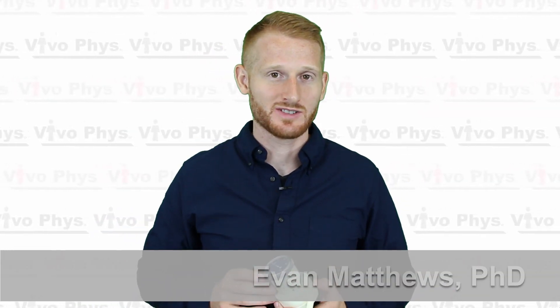Hi, I'm Dr. Ever Matthews. I'm here at Montclair State University in an exercise science lab to show you how to use a very simple windmill type spirometer.